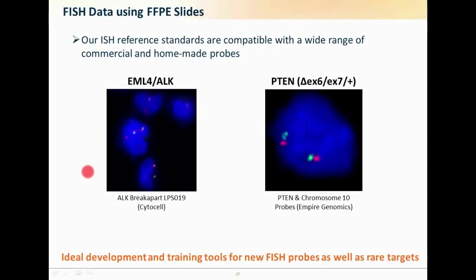And so, if you have reference slides and you can optimize your technique with reference slides, it then will give you great confidence that you can apply those probes to your clinical samples, rather than almost wasting your precious patient material on setting up assays and testing assays, you can do a lot of that research and development work using reference slides.